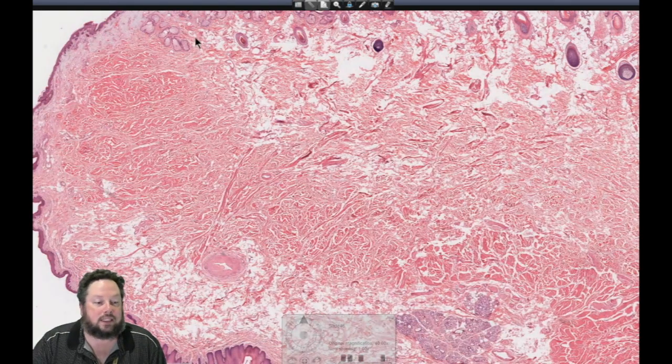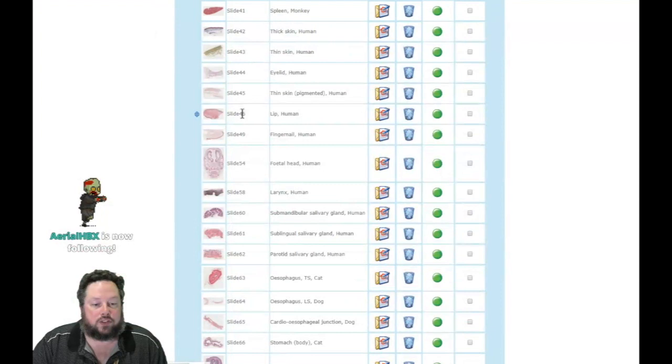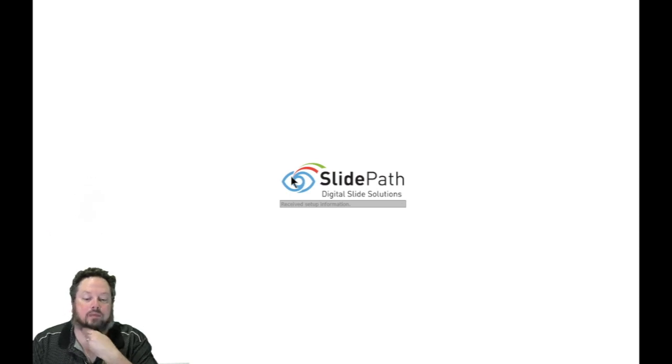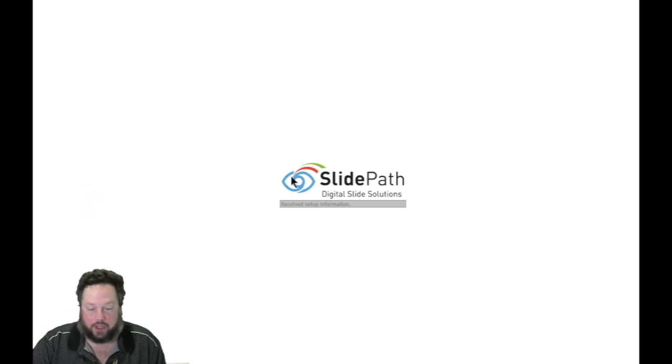All right, so let's have a look at another slide then. So we're going to have a look at the oral cavity, and we've got a section here which is taken from an old specimen that we used to have lying around.